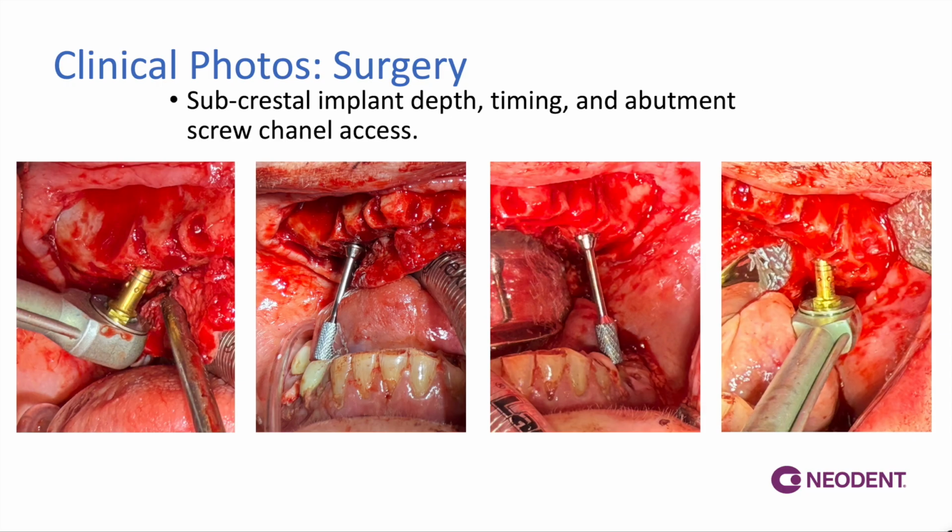And so we use the opposing arch to help guide our screw channel access, and that dictates the proper timing of the implant, as you can see, as we rotate that around with our driver. And again, we are preferring a 1 millimeter subcrestal position with a 1.5 millimeter abutment.